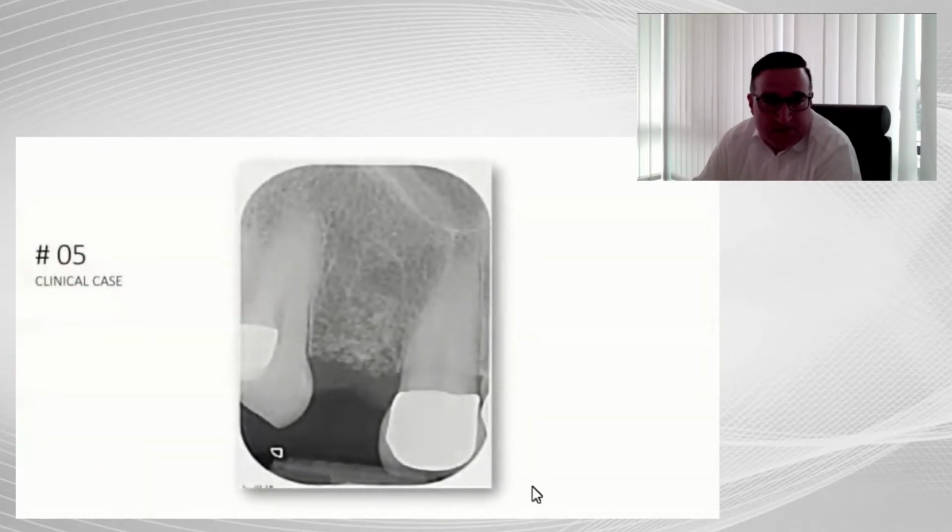And again here, the post-operative X-ray of the extraction. Also here, please notice the structure that CERASORB foam shows in comparison with the surrounding bone structure, which I said before, it's always, for me, very interesting to see that.